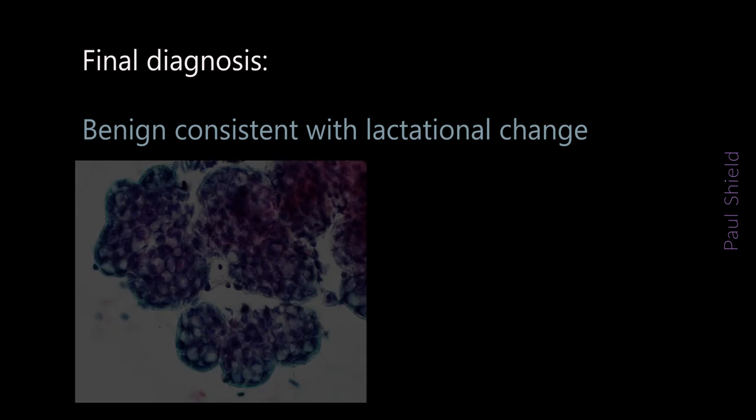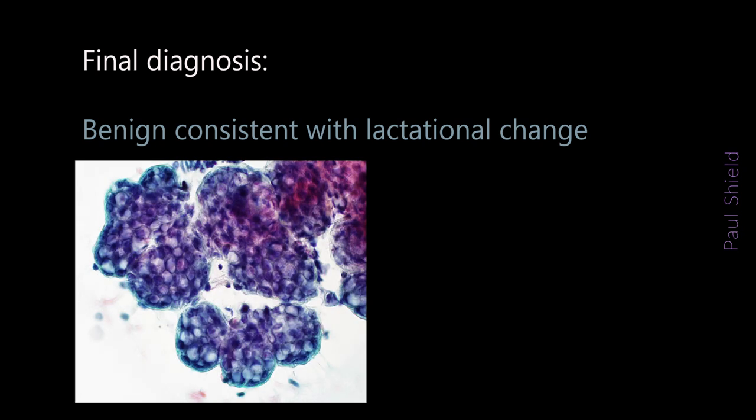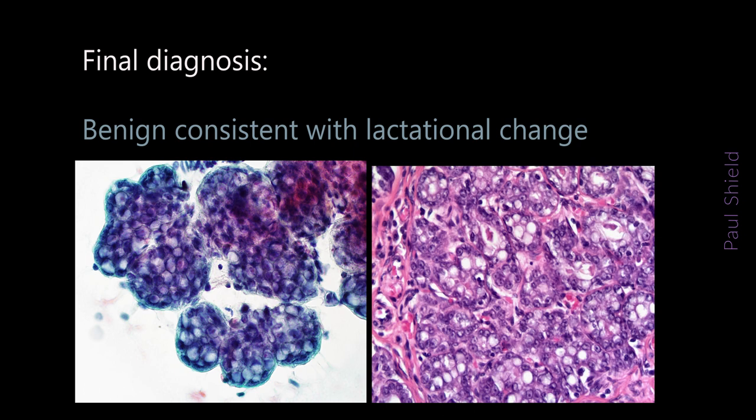Sometimes you get predominantly large tissue fragments, which are essentially lobular units showing hyperplastic change and vacuolation and reflecting really the histology that's seen in lactating so-called adenomas. Clinical information is therefore really helpful in these patients.